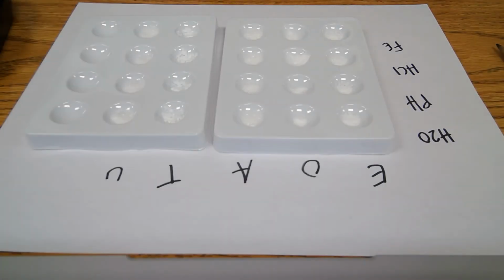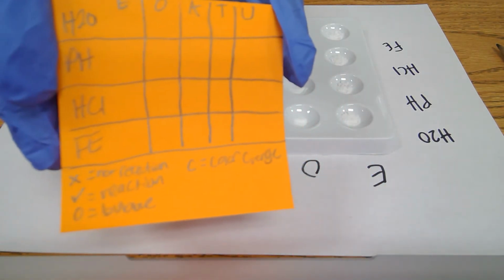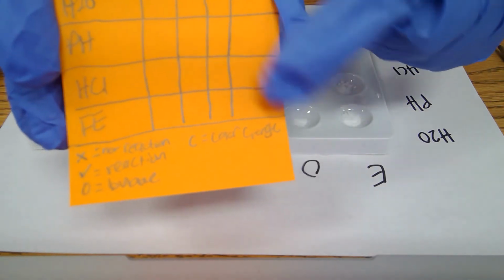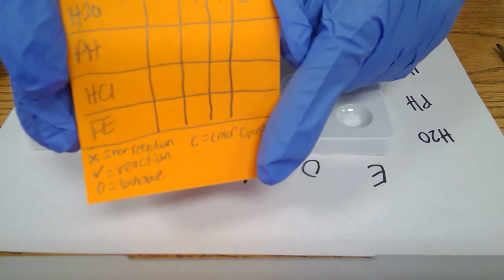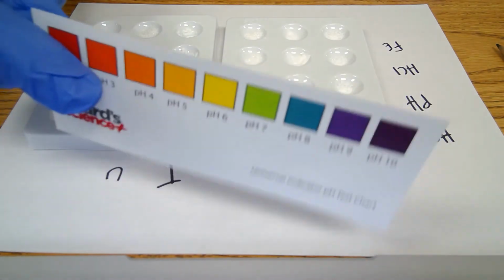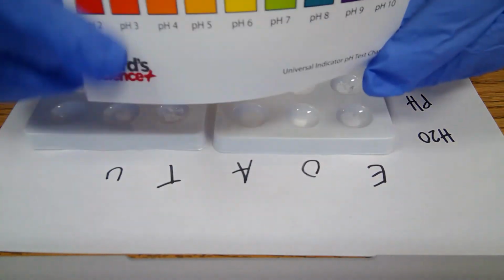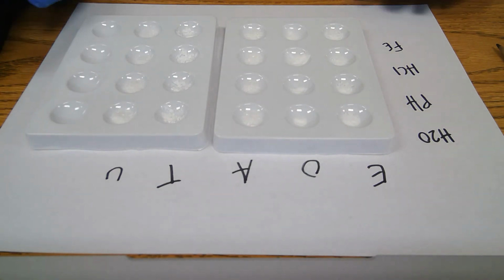Okay, so now that we have all the respective drugs built, I made a little key to keep track of the changes in color as well as any reaction or no reaction. This is just something I personally did to help me out. So I'm just going to begin the process of putting the fluids within each drug to see what the reactions will turn.